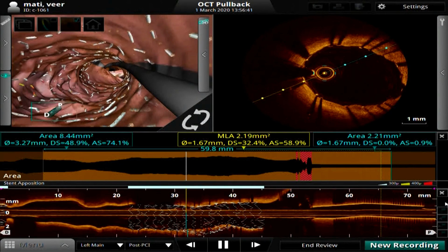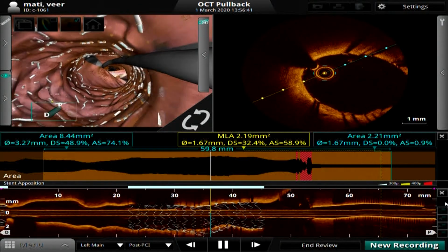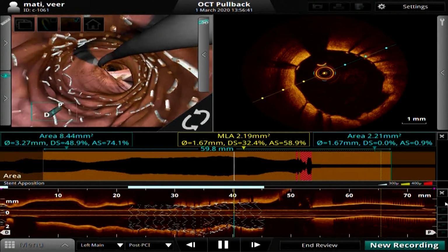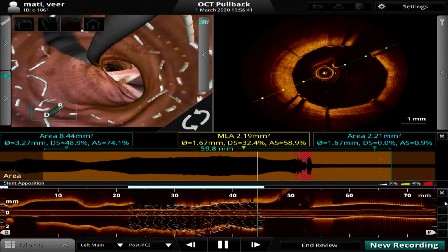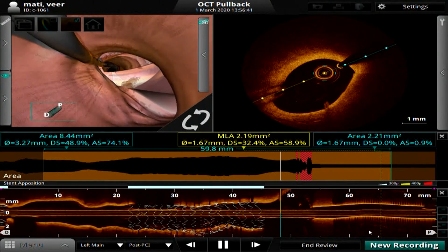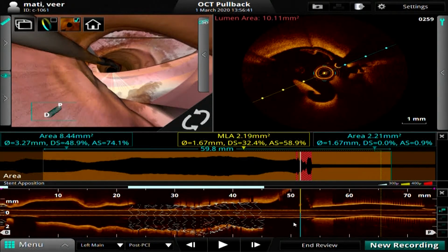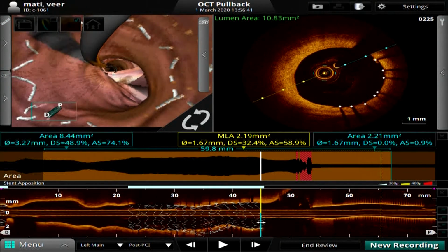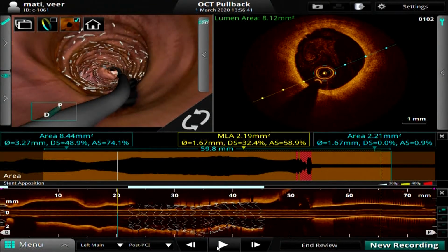So it's a well opposed stent across the left main, which was dilated with a 4.5 millimeter balloon. Looks okay. And this is the proximal segment, which is fine. Looking good. I think there was a little catheter tip ellipticity of that area, and that is what was showing up differently in orthogonal views.